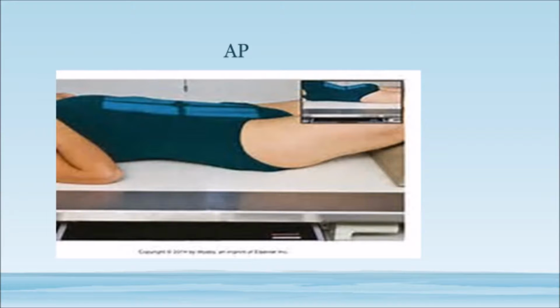The CR is perpendicular to the IR and is directed to the level of the iliac crest. Suspend breathing on expiration and collimate on 4 sides to the anatomy of interest.